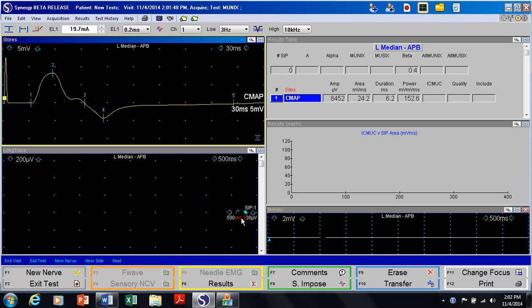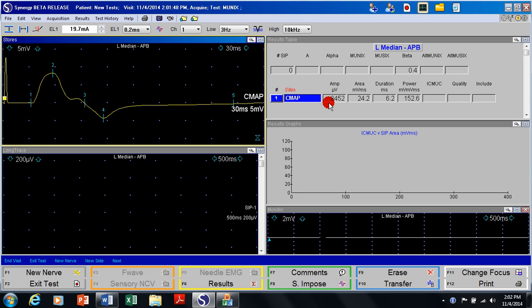Now usually we change the position of the E1 electrode to make sure that we are recording the CMAP with maximum amplitude. In the interest of time I will accept this as the CMAP with highest amplitude. Amplitude is shown over here. Here is the area, duration and power.